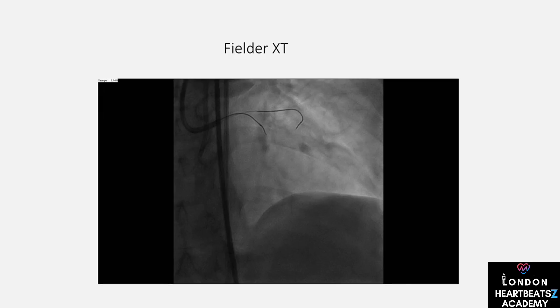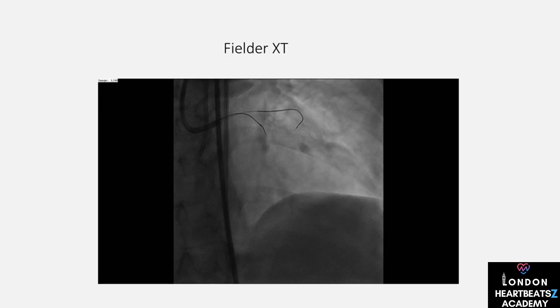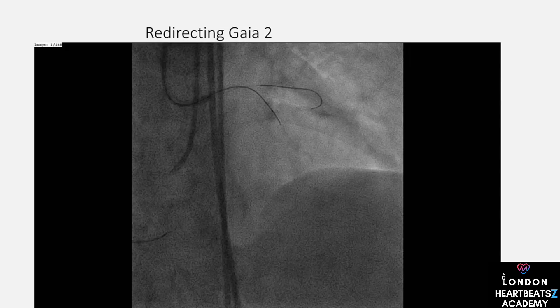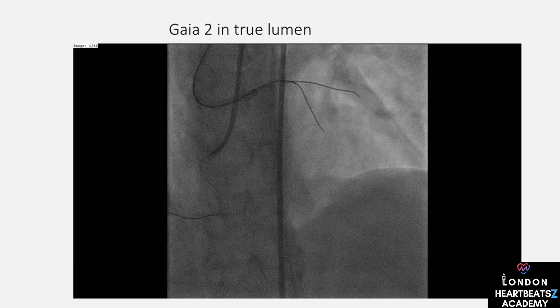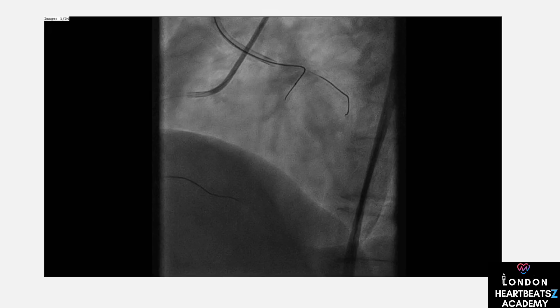Redirection is another crucial skill, and the Gaia wire is our ally here. We use visual cues to identify when it's time to redirect the wire — like adjusting your sails to catch the wind. We track through loose tissue and redirect as needed to stay on course.